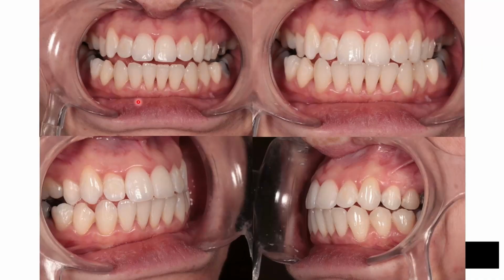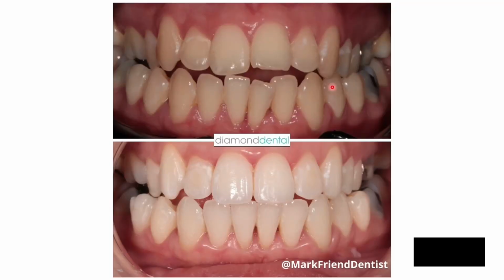We're able to see some of the mottled areas that we were able to see in the outline. They've really regressed under the power of whitening, a nice, clean, very healthy looking smile. And we turn it from that to that using some really very simple moves.